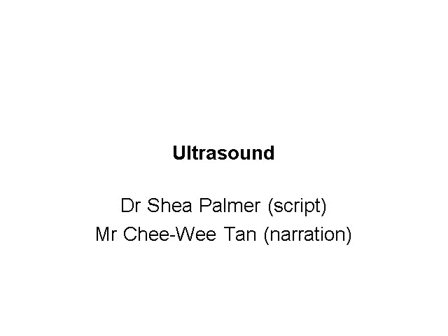Welcome to the narrated lecture on ultrasound, which is by far the most commonly employed electrophysical modality. Ultrasound uses high-frequency sound waves to affect physiological processes within the body and also via mechanical vibration to cause heating. It therefore has a range of non-thermal effects and thermal effects similar to those previously outlined for other forms of heating.